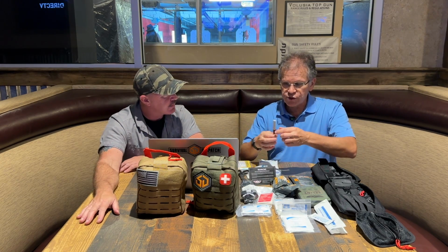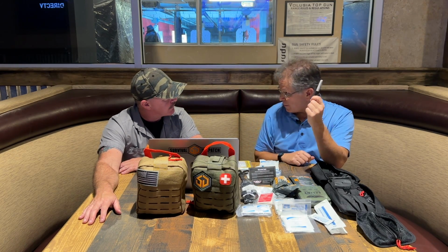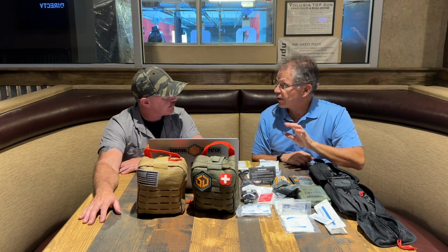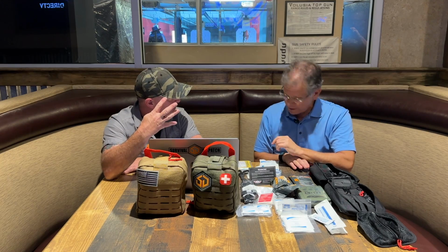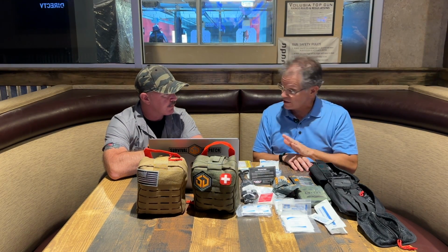There's also what's important, there's a little marking pen, and this is when you put the tourniquet on, you put the time on there. Oh. Okay, it's good you can put a tourniquet on for up to 4 hours without any major problem. Because 4 hours? Yep, people think if you put it on for more than 30 minutes, you got to loosen it or you'll lose the limb. That is not true. Oh.